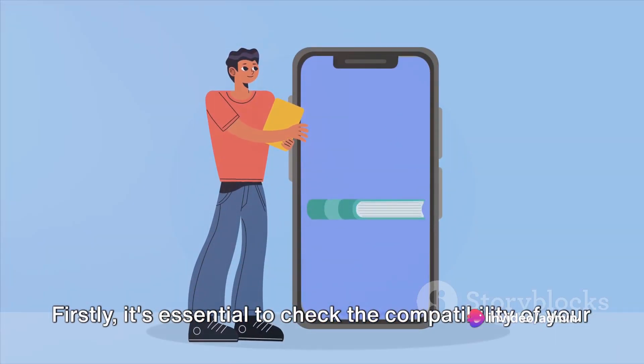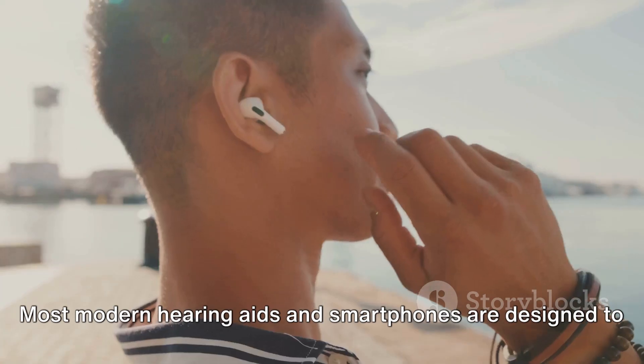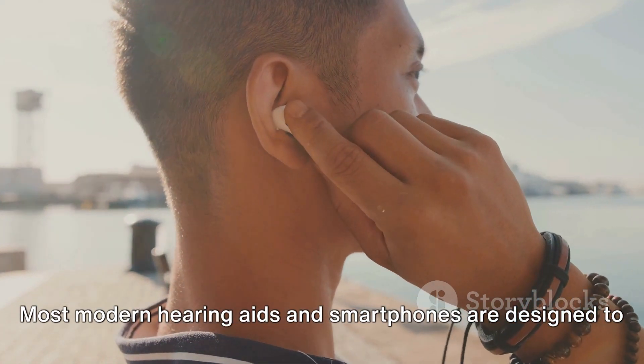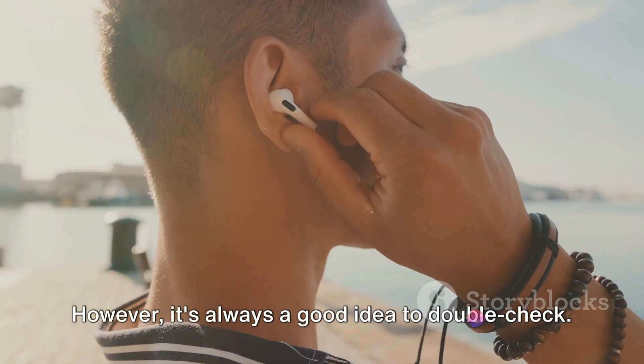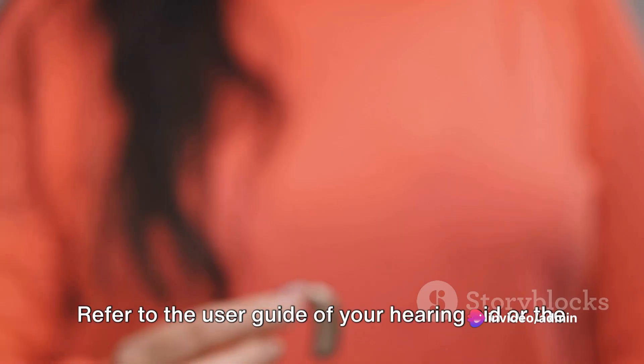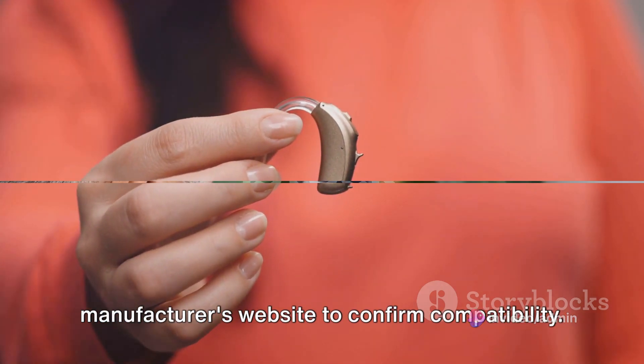Firstly, it's essential to check the compatibility of your hearing aid with your mobile phone. Most modern hearing aids and smartphones are designed to work seamlessly together. However, it's always a good idea to double-check. Refer to the user guide of your hearing aid or the manufacturer's website to confirm compatibility.